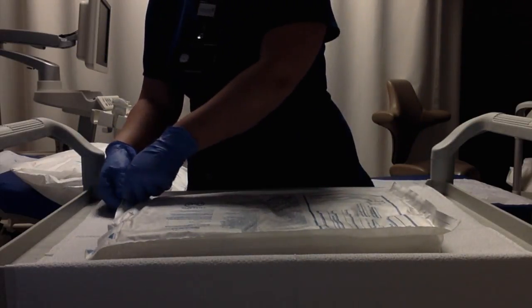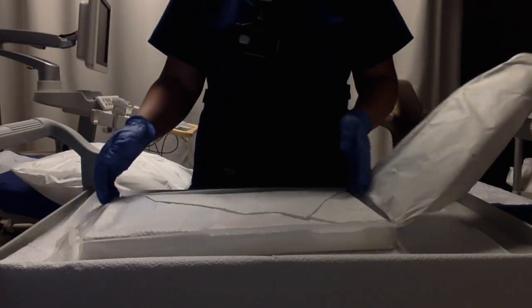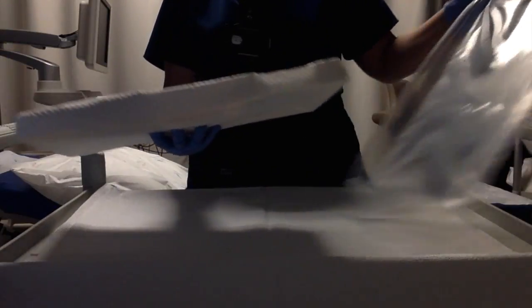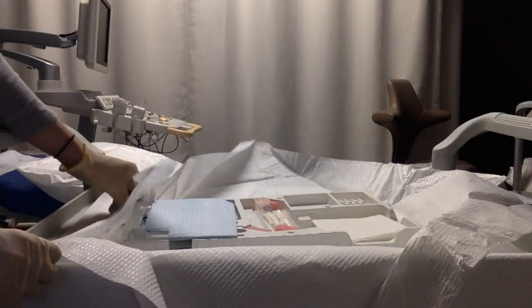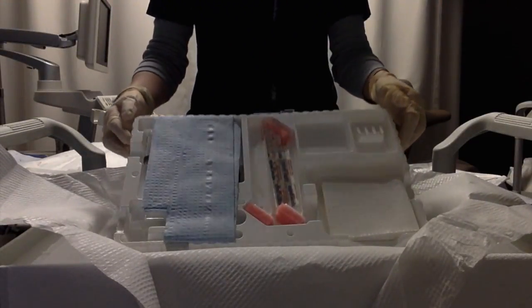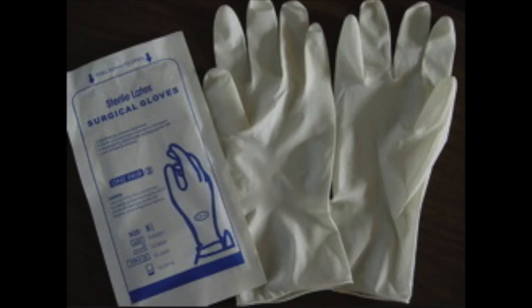Once the radiologist chooses the fluid pocket of their choice, aseptic or sterile technique should be used to prepare and complete the procedure. Sterile technique prevents contamination to the patient and to the specimen being obtained. A thoracentesis or paracentesis tray has all of the needed equipment inside, but must be opened using sterile technique by not touching anything inside without sterile gloves. Therefore, the outside covering of the tray should be unfolded using regular gloves. After opening the tray, the participating providers should put on sterile gloves for the remainder of the procedure.